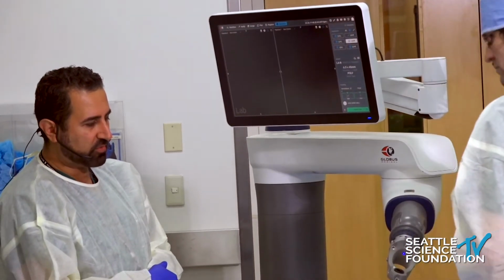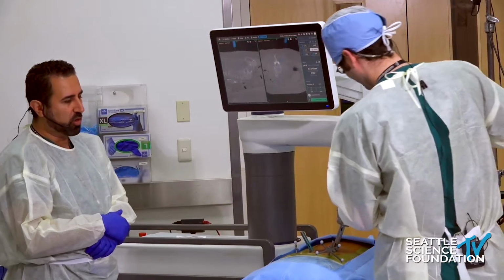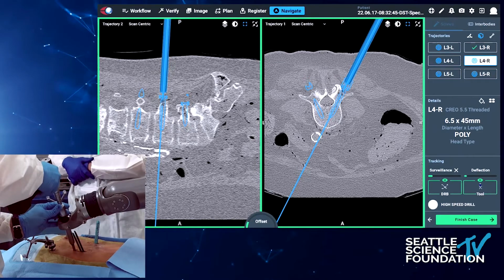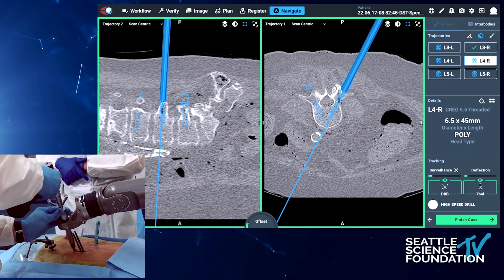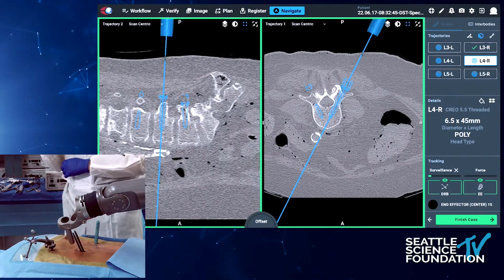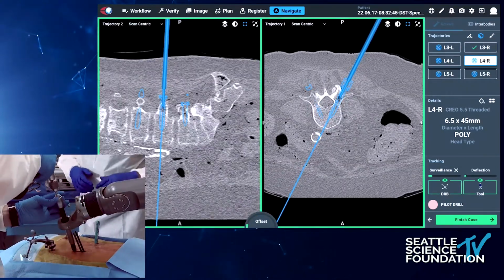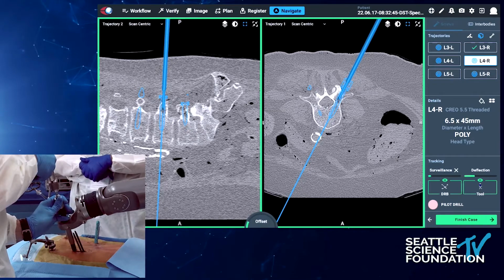The other answer to your question with skiving is that the reason we use the high-speed burr is that we need to place the pilot hole in the right spot, because each subsequent instrument will tend to follow the trajectory or the track of the pilot hole. So the pilot hole matters. So you can be judicious about it. The tube itself is rigid, and it's really intended for a direct placement of the burr, the drill, and the screw, but it does allow for some micro motion. I've talked about the micro motion, micro adjustment. So I can look at the screen, believe the image or not, and if I find, for example, that I'm skiving constantly, replan the screw to avoid that trajectory and hopefully achieve my goal.